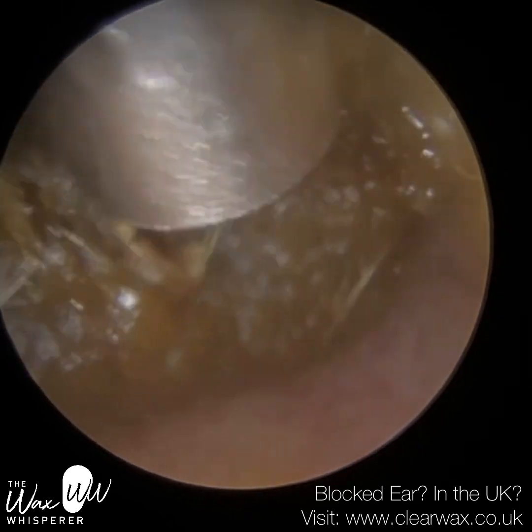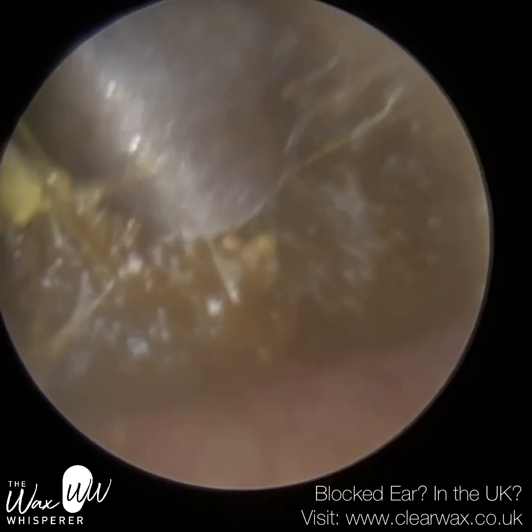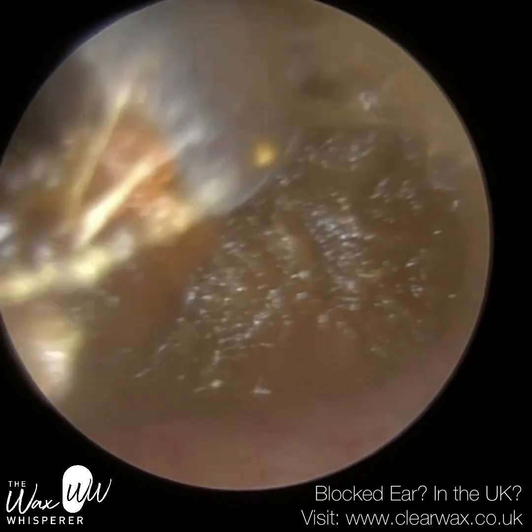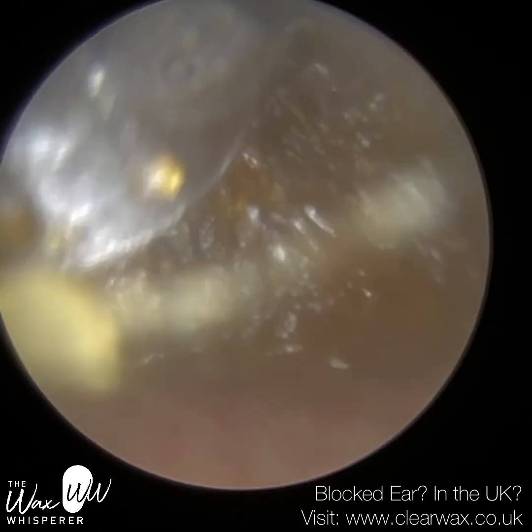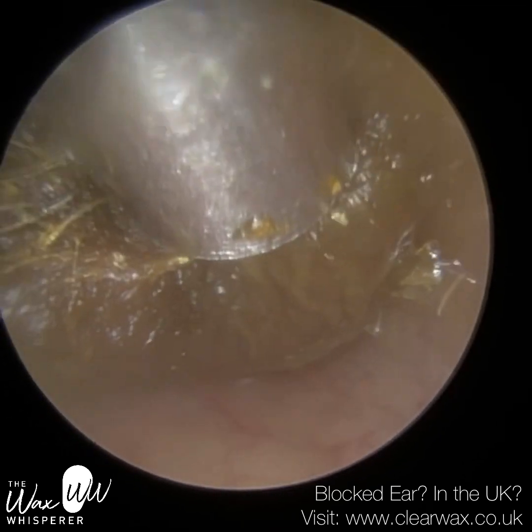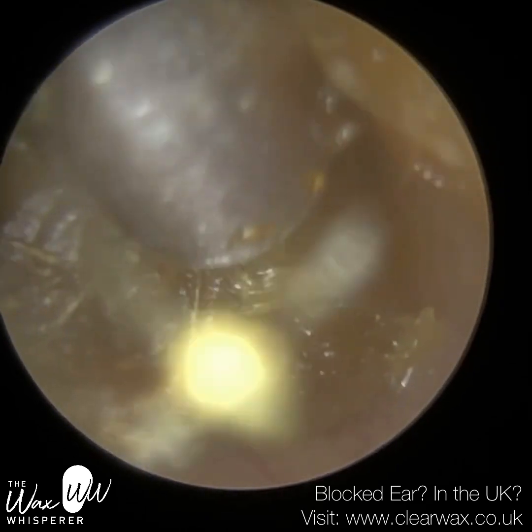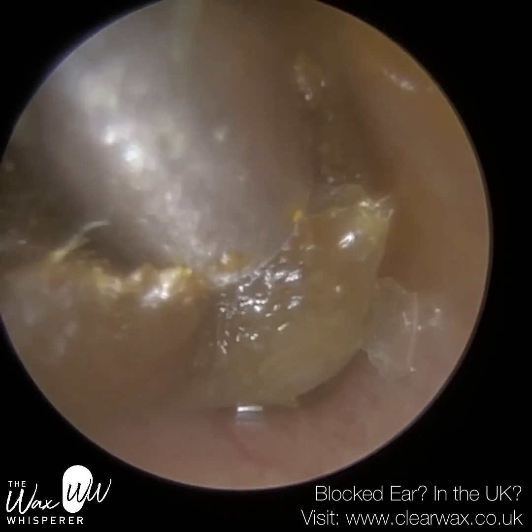What the oil will do, will do several things. It'll help to lubricate the ear canal wall, so there's less friction as I'm bringing this wax plug out. It will also lubricate the inside of the suction probe to prevent the wax from getting blocked. And it also helps to bind the wax together. When you've got a very dense, soft plug of wax like this, if we can firm it up slightly and bring it together, the plug can come out in a single piece.